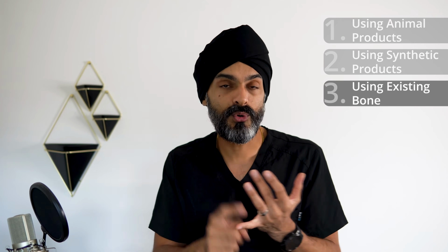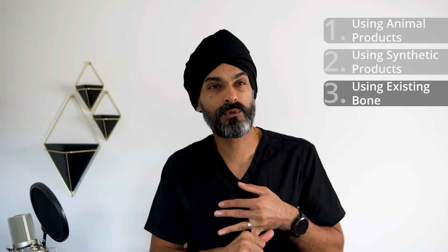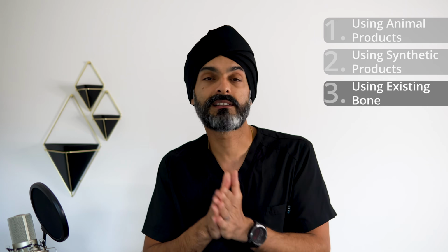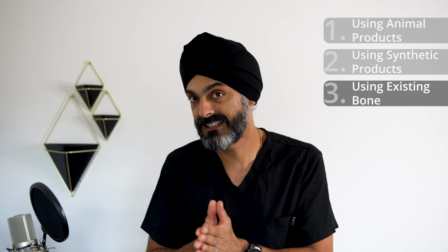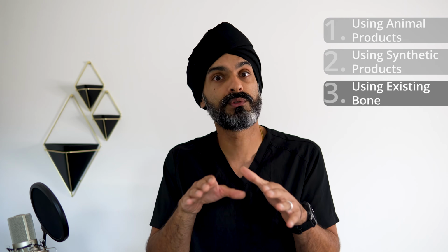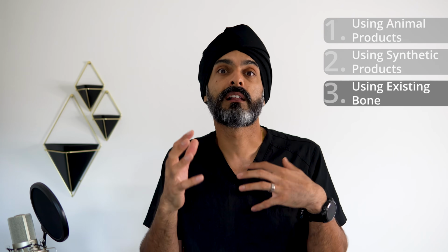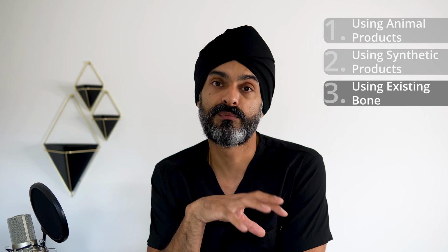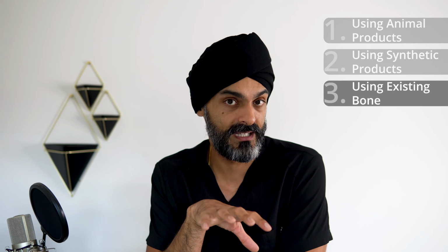Okay, it's got all of your growth hormones. I think it's got like 42 different growth hormones, which are specific to yourself. Our chances of rejection are very little, and even if we get a complication like the wound opening a little bit, there's a lot more flexibility. It takes a lot more for a bone graft like this to become infected.